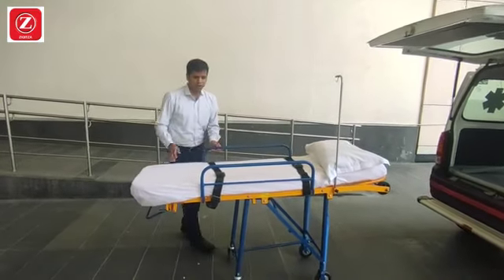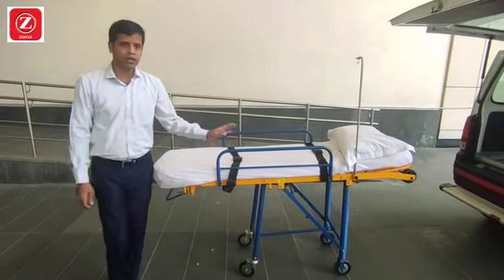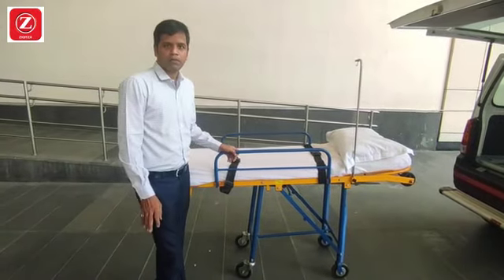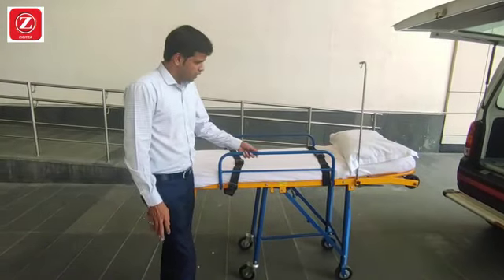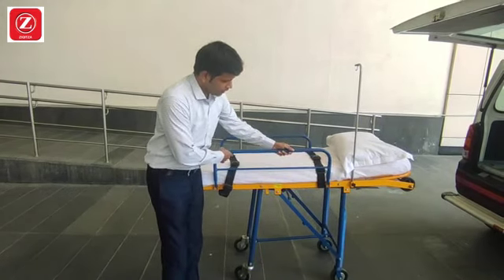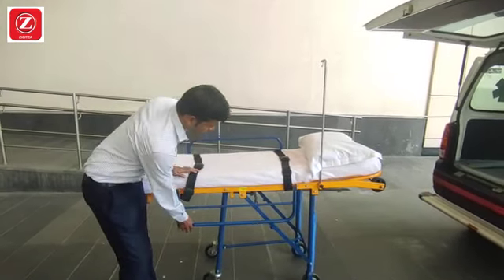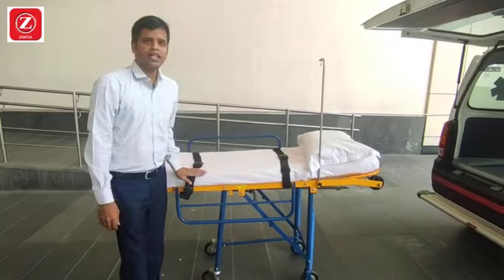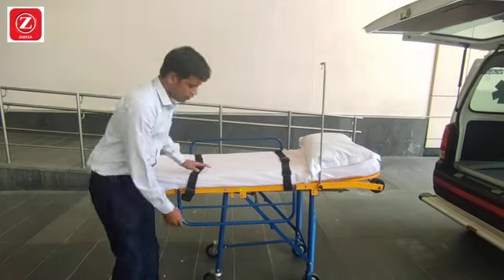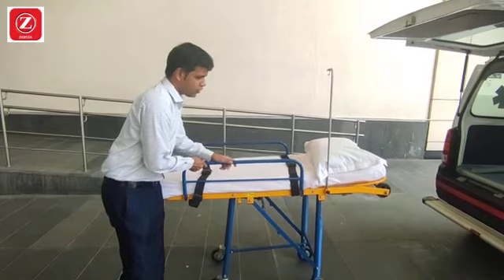When the patient is secured at this point, take the patient's side railing and put it up into position on the side railing.